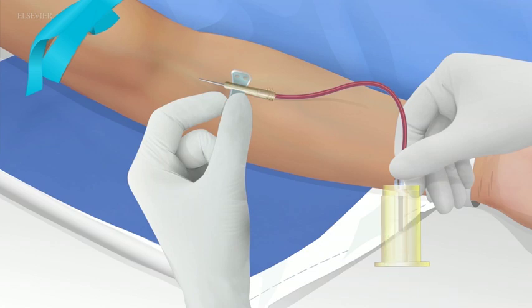Detach the collection barrel from the aerobic culture bottle and insert the sheathed needle through the rubber stopper of the prepared anaerobic bottle. Ensure that the anaerobic culture bottle receives a minimum of 10 milliliters of blood. Detach the collection barrel after the anaerobic bottle is filled with 10 milliliters.